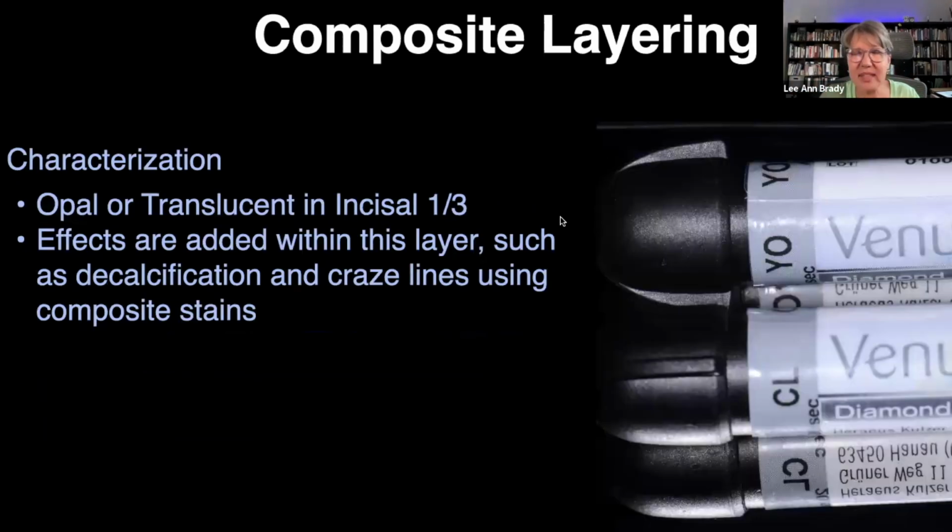And then now you should be left with about a 0.5 millimeter layer that's on the labial of the final restoration. And again, within the confines of the restoration, not bulked out on top so that you're going to trim it all off. Okay. And this is where you add characterization, staining, and you want to really mimic the look of natural enamel. Okay.